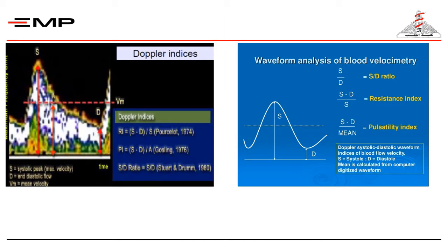Details of how different indices are calculated are not part of the undergraduate curriculum. However, some clarifying notions might be more elaborated during our face-to-face encounter, as well as during your visit to the fetal care unit during your clerkship activity session. It's worth noting that the machine is computing the resistivity index, the pulsatility index, and the S/D ratio.